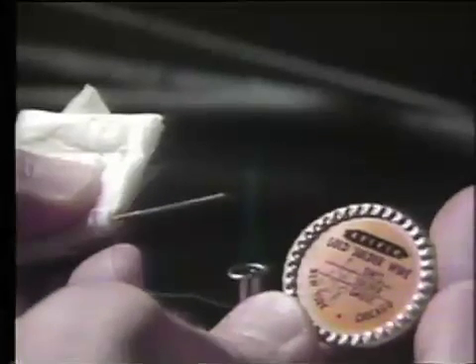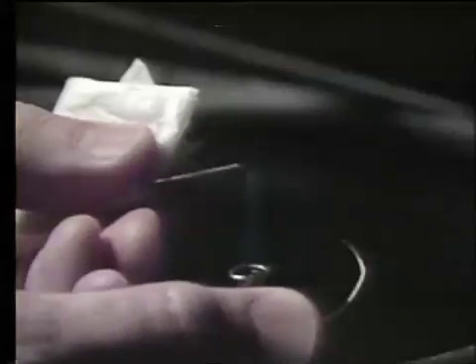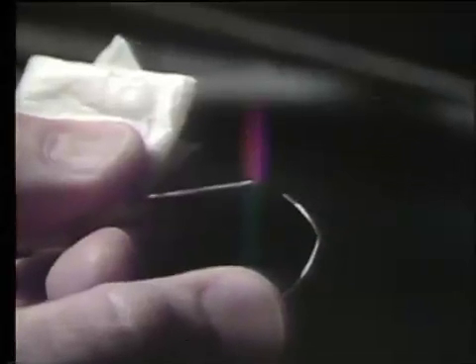Gold solder is used for this procedure. To add the gold solder to the end of the wire, you hold the end of the wire in the soldering flame, heat that wire, and then touch the gold solder onto the end of the wire itself, forming a small half-ball of solder.